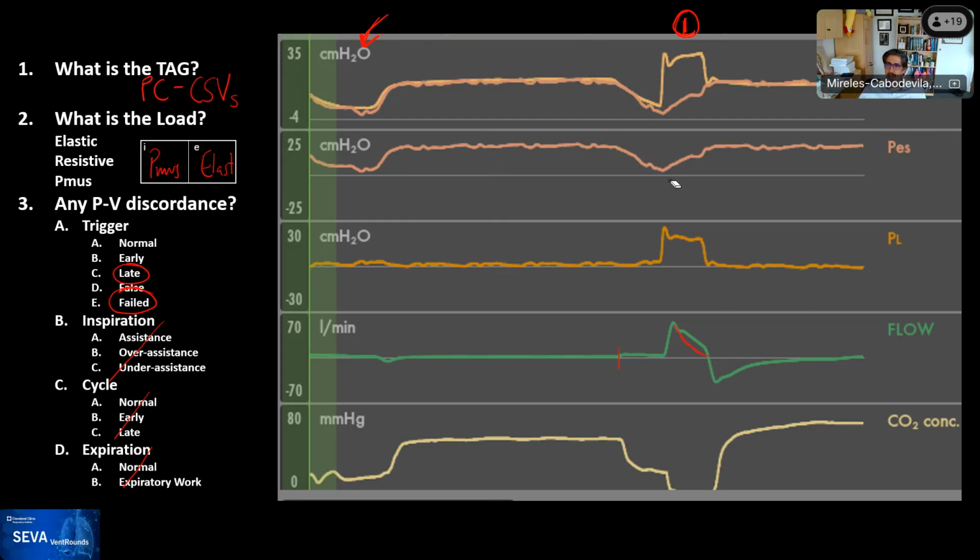So what's the equation? There you go, Megan. Very good. The airway minus the pleural pressure. So that's the equation. Now we use the esophageal pressure as a surrogate. We use the esophageal pressure as a surrogate. And so it's airway pressure minus esophageal pressure. All right.